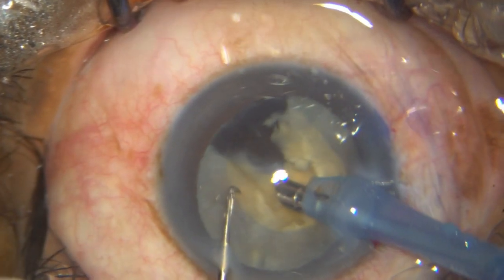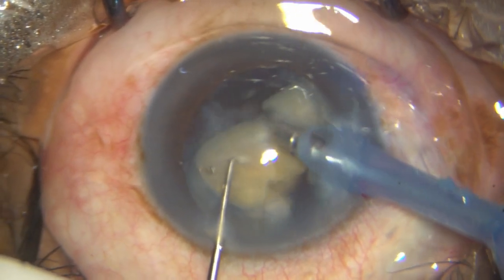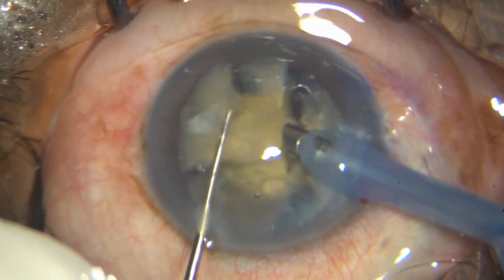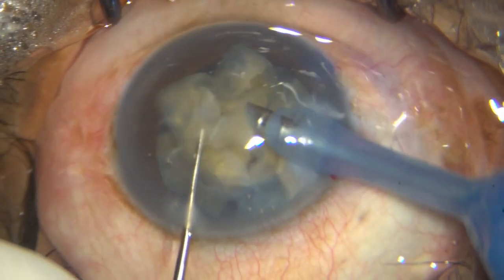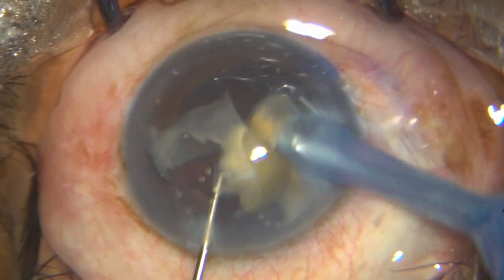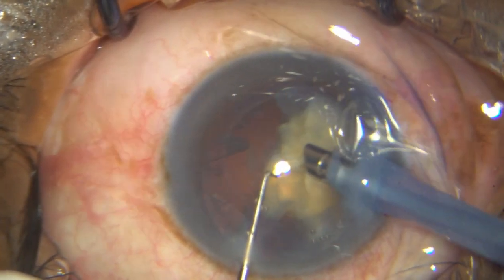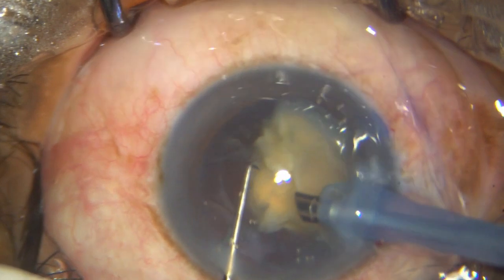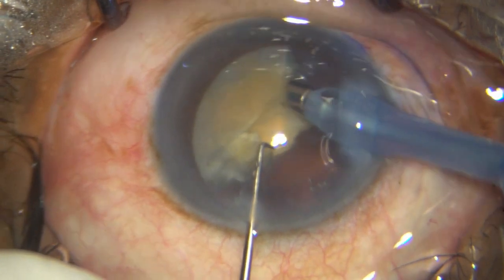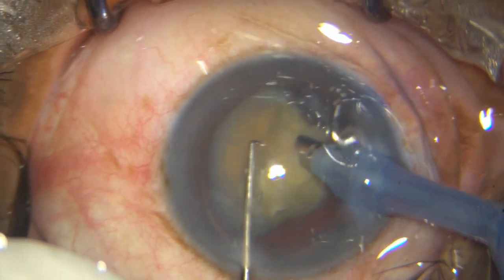So I decide to take off the smaller piece rather than it flying around. I then target this, and now look, it's difficult to control this tilt. So I start eating up this, just tilt it a bit, target that apex and start eating, and that's it. So my main aim here is not to allow pieces to fly around in the anterior chamber, hitting the endothelium. And mind you, I haven't reduced the vacuum, I haven't reduced the flow rate. I am at the same continuous power of Phaco.